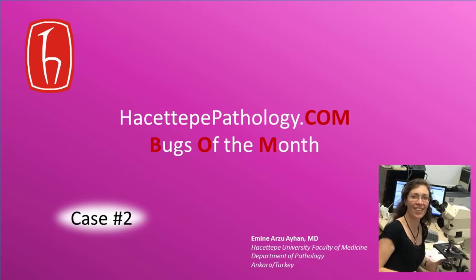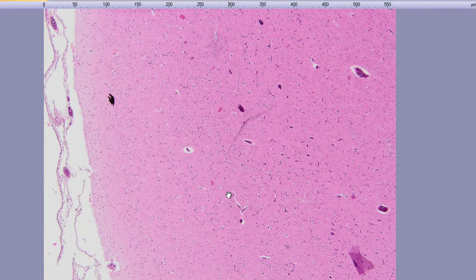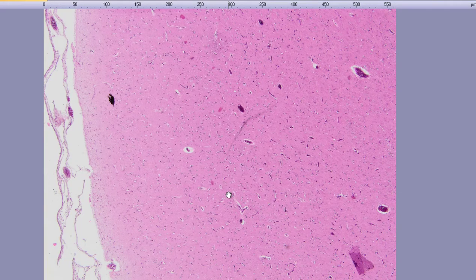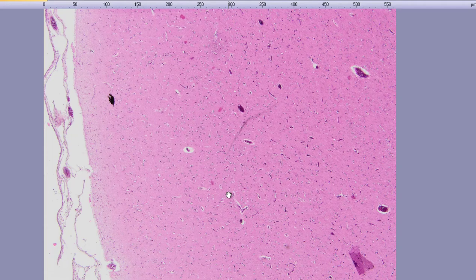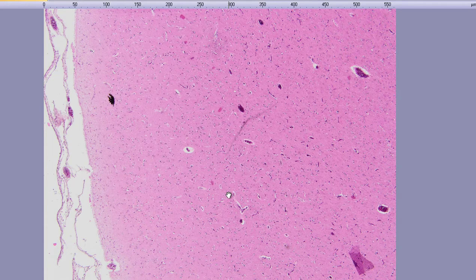Hello everyone and welcome to another session of Bugs of the Month. This time we are going to be looking at a brain autopsy from the archives and it belongs to a 23-year-old female patient. We are told that she was being managed with steroids for systemic lupus erythematosus for the past three years.